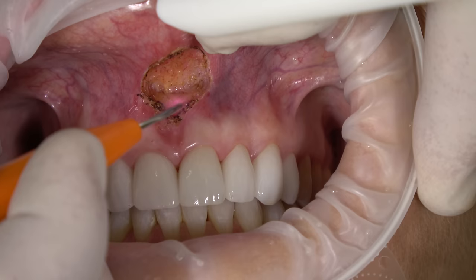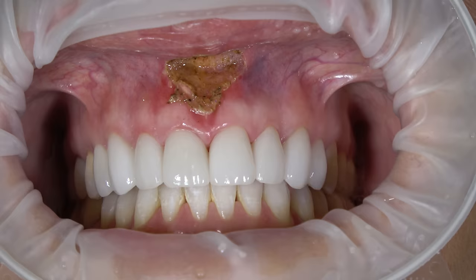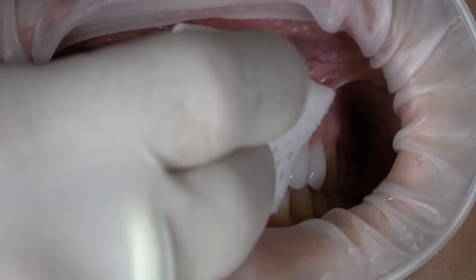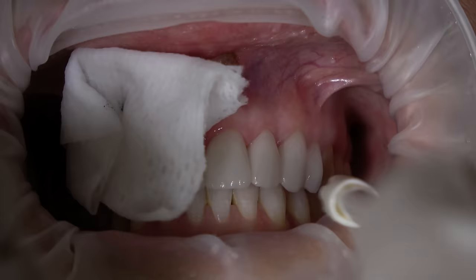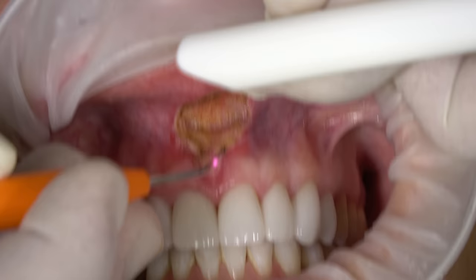No post-operative discomfort, no bleeding, and we can reach the periosteum. Getting a little bit more char than I would like here, so I'm just going to turn it down.